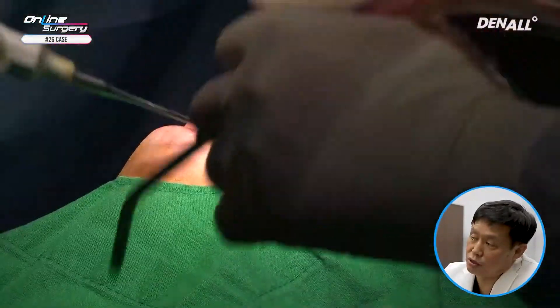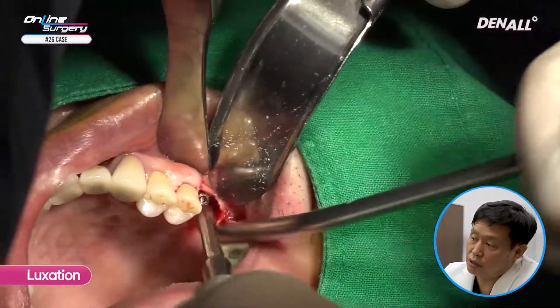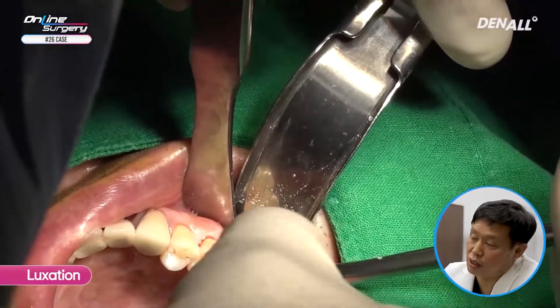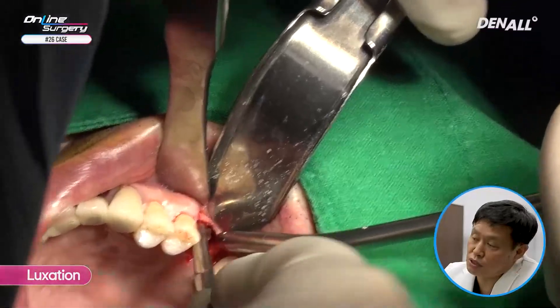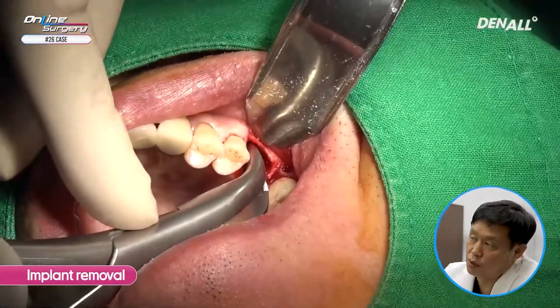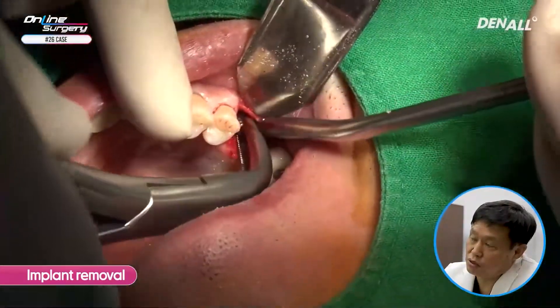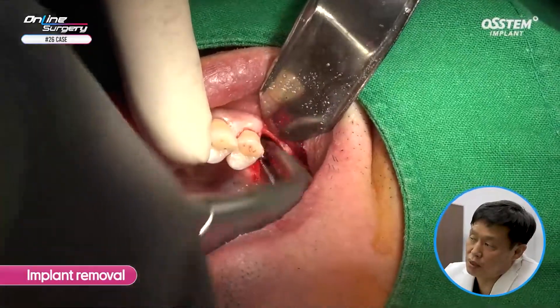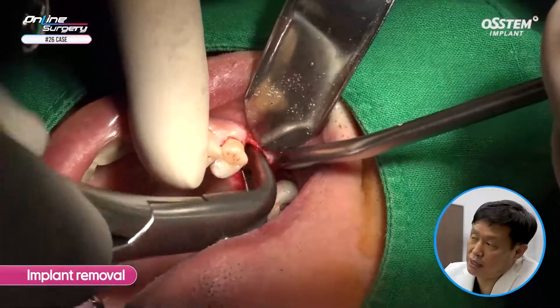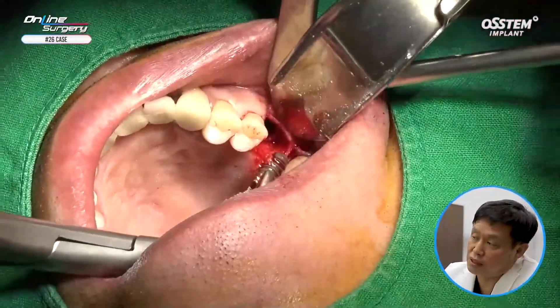I am going to try to avoid buccal plate damage as much as possible, then use the elevator to luxate it. You can see it is slightly moving. Once it is moving, I am going to use the forcep to remove the implant. It is quite nicely osseointegrated. Fortunately, I was able to remove the implant without damaging the buccal plate.